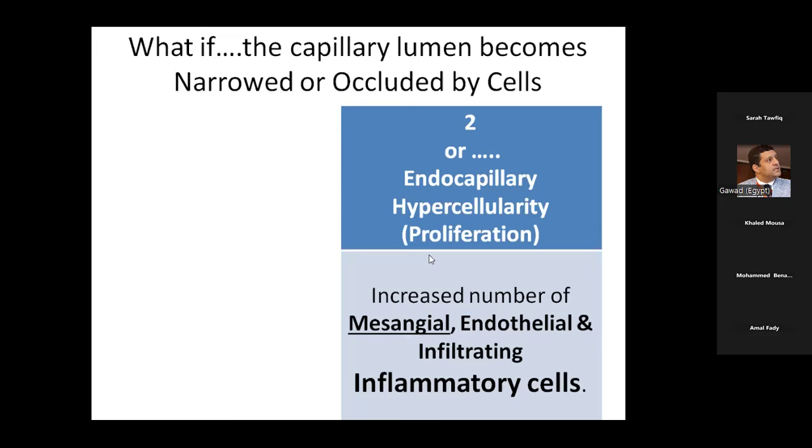It's just the start of TMA. The start of TMA is just like this pathogenesis. It's an endothelial injury. This can occur with accelerated phase of hypertension, with TMA secondary to any autoimmune disease, with TMA of complement mediated disorders. All of these disorders can cause endothelial injury that will be seen like that. Okay, so that's one way of thinking.